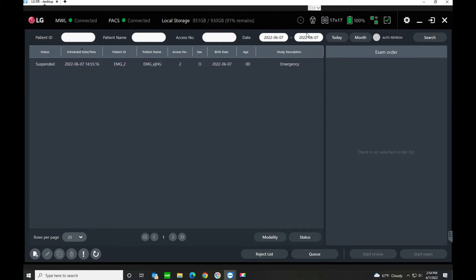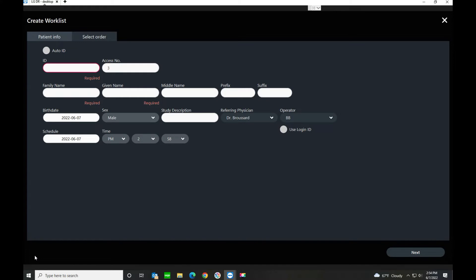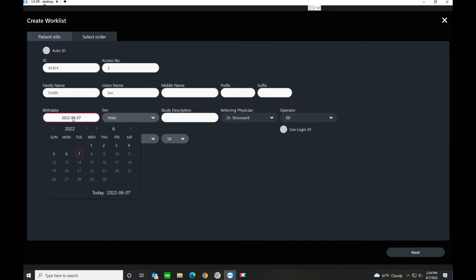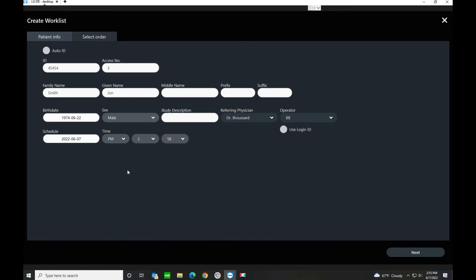What we'll do here is simulate setting up a new patient, assuming we didn't have modality worklist. We would come down to the bottom left corner and select Create Worklist. We assign a patient ID, a family name — say John Smith — go to the birth date, highlight the year, type in the year, tab over, type in the month, and then select the birth date.